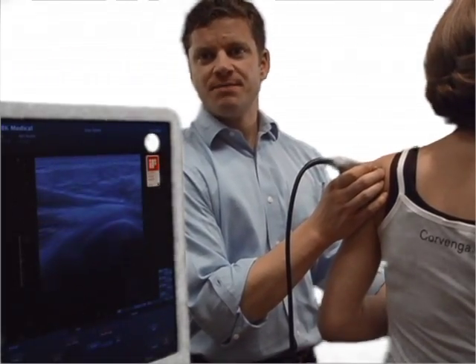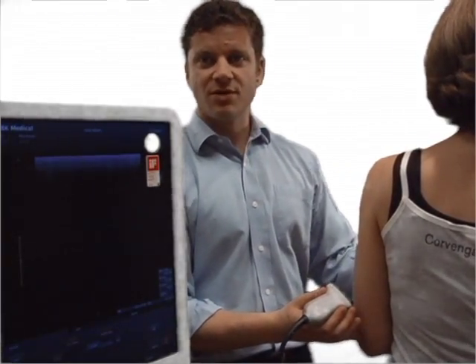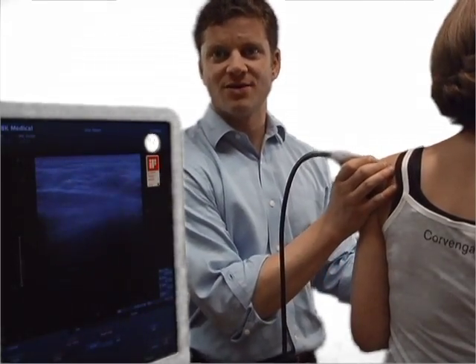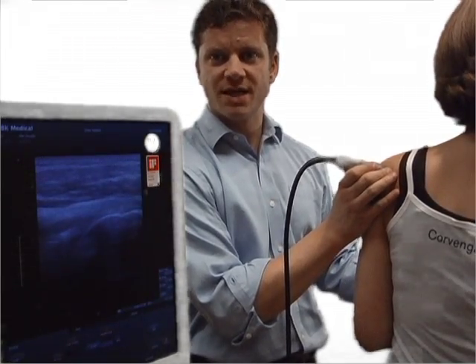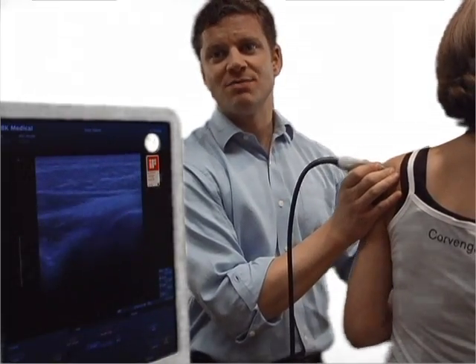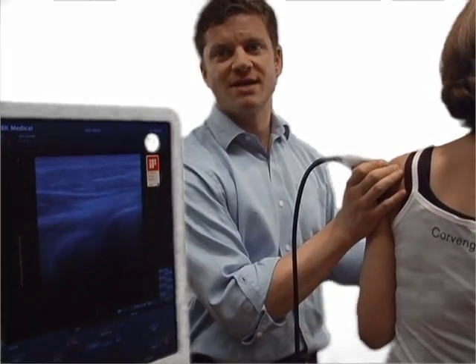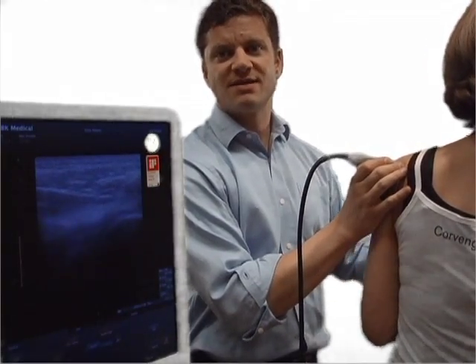Here's the anatomy we're seeing. I'm going to have the patient keep the elbow next to the body and grab their hand and ask them to dance — letting me take the lead. That's important because if you just tell them to move their hand, their arm goes all over. What I want to visualize is the humeral head, the infraspinatus, the glenoid, and the labrum. Ultrasound is dynamic, so I can have the patient move to help me identify the structures. Here I'm rotating the humeral head by grabbing the patient's hand and externally rotating with the elbow at the side, and you can see the circular surface of the humeral head and the infraspinatus attached to it.